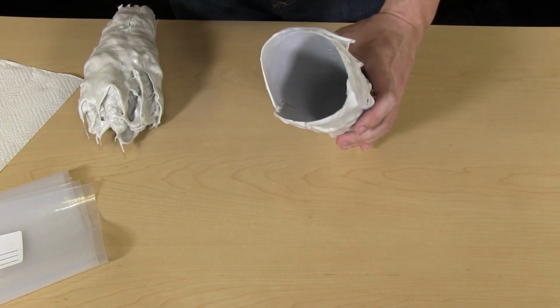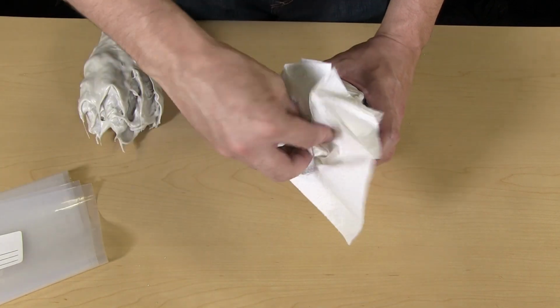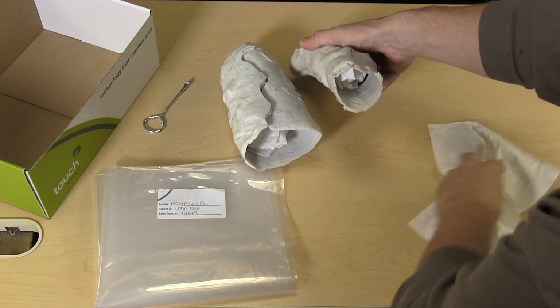Please pack the impressions with paper towels. This will ensure that the impressions hold their shape and form during the shipping process. Heat and shipping time can cause impressions, especially large ones, to sag and lose their shape.